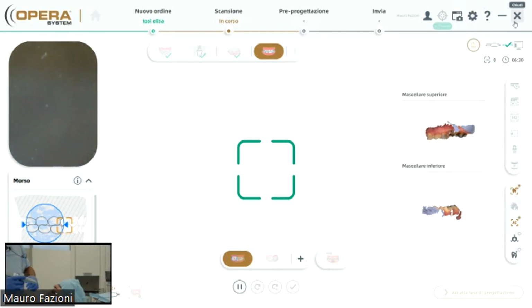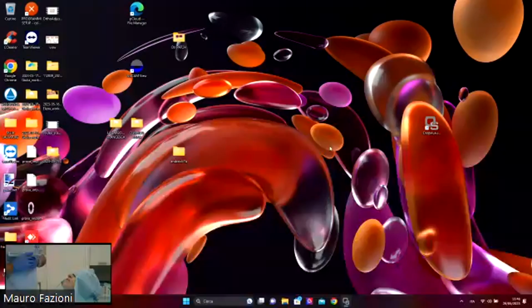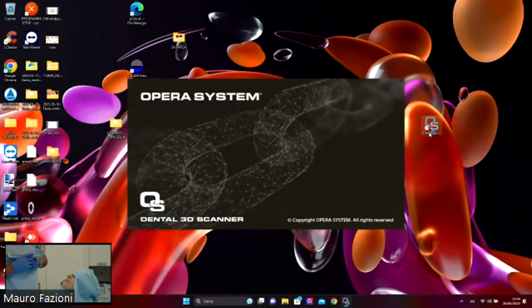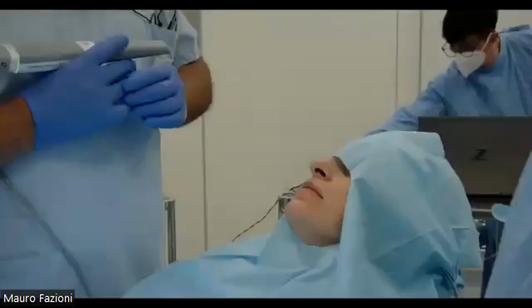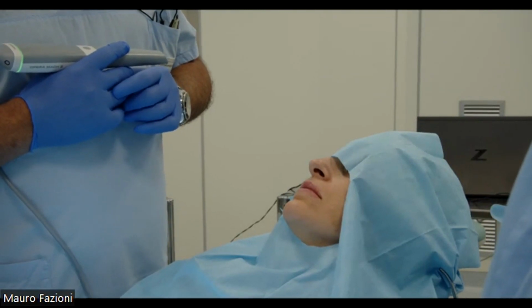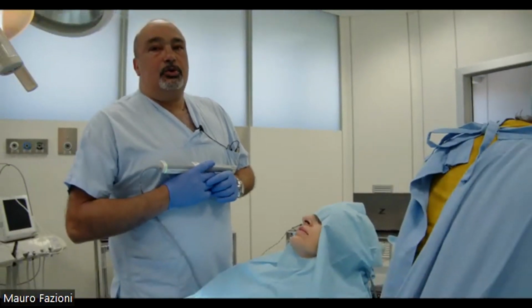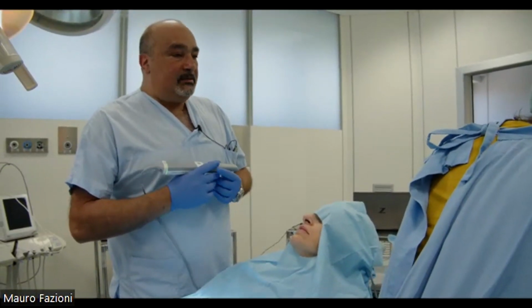First of all, setting here, this patient needs a customized abutment. For us, the customized abutment solution is the normal possibility in all our implants. All our implants are surgically guided, with the direct solution for a customized abutment.